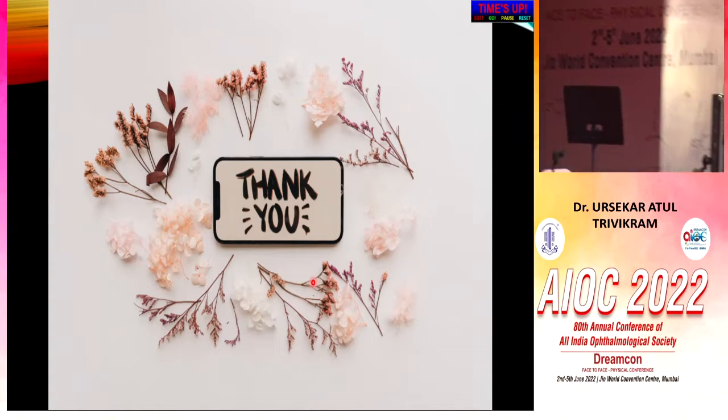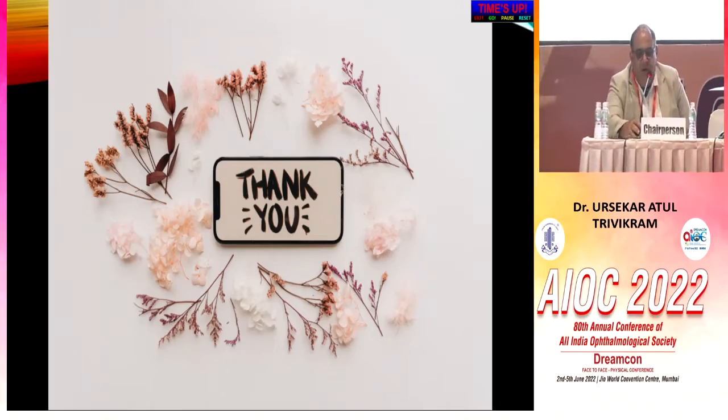I would like to ask a question of Atul and get an opinion from Anirudh also. First of all, if you are using the forum software, you are able to do the correct segmentation on your table, which your technician might not have done. So that's one advantage I see.